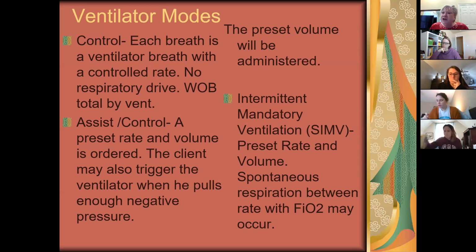And it's really up to the human that's following this patient to say, you know what? They got 16, but they're actually breathing 24. Do they really need that 16? So maybe they're on the wrong mode. That would be for us and the smart people of it to say that we're not doing it right. We wouldn't let that go on for a really long time. You see what I'm saying?